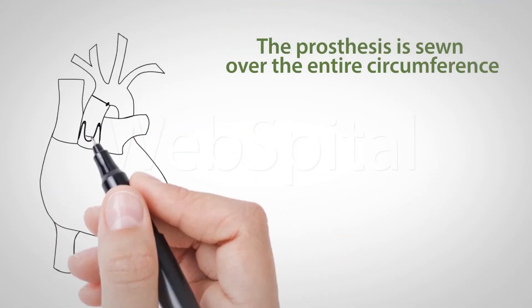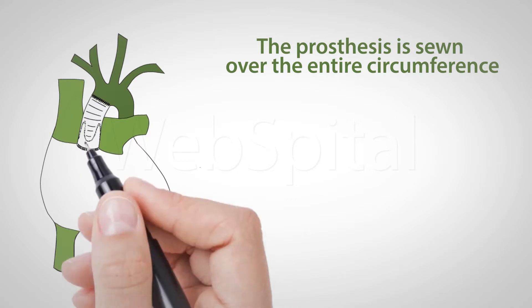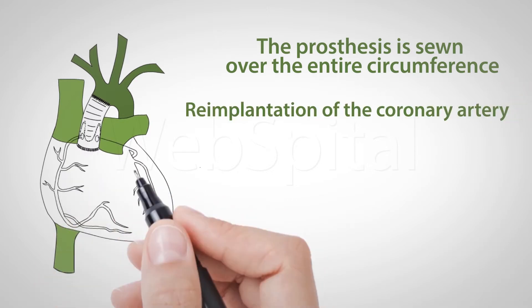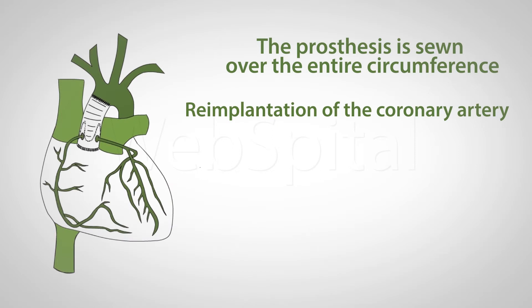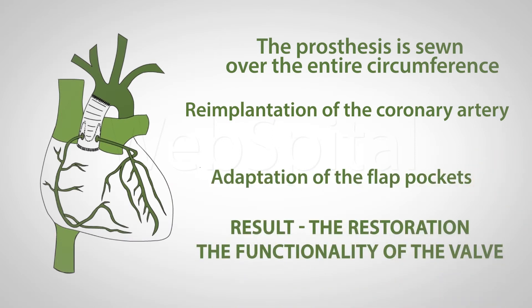In the end, the prosthesis is sewn over the entire circumference. Since the prosthesis diameter is smaller than that of the resected aortic root, the flap pockets are closer to each other and the leaflets are competent.